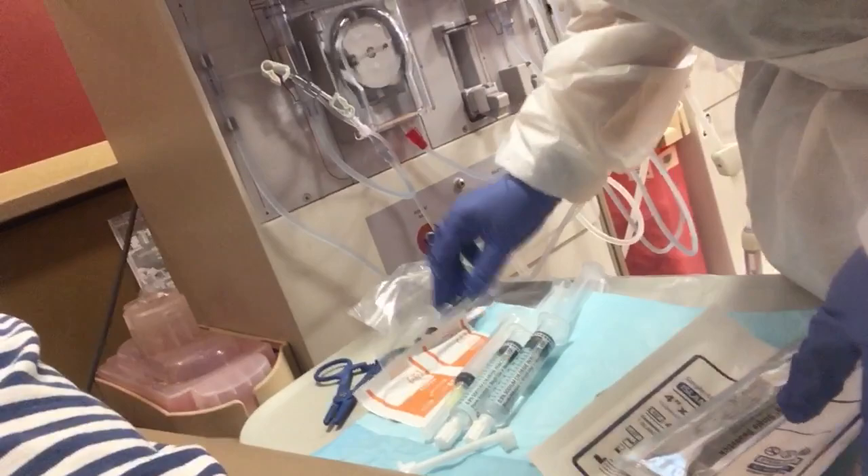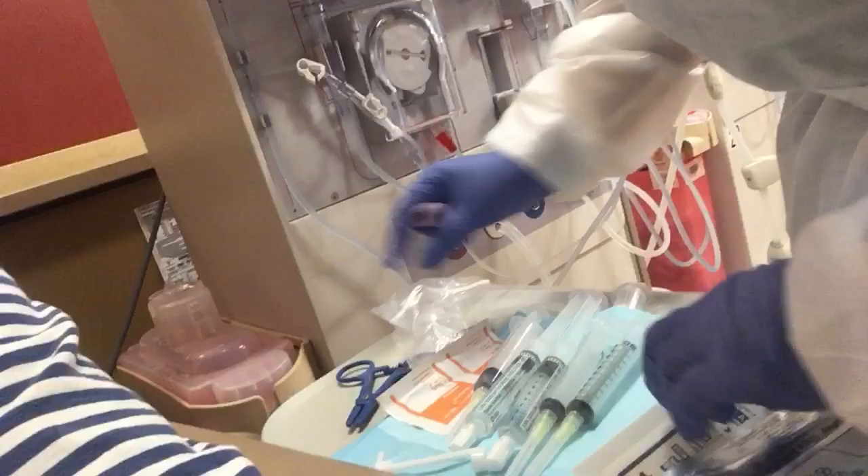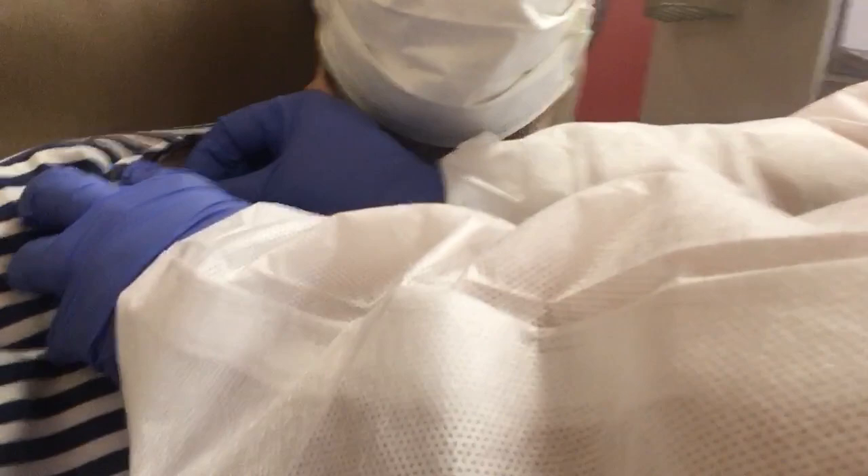Right now we're preparing the devices, getting the syringes and things prepared. These are going to get my blood started and draw a bit of blood, which will be hooked to a machine. This is the unwrapping — this is called a cannula catheter port.